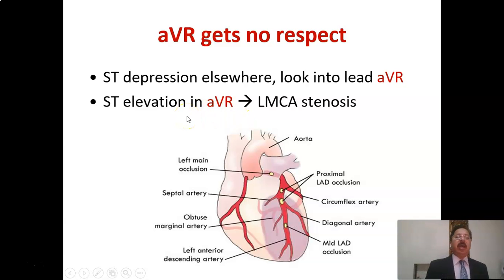ST segment elevation in aVR in presence of ST segment depression elsewhere is left main coronary artery stenosis. So it's extremely dangerous, this left main coronary artery occlusion.